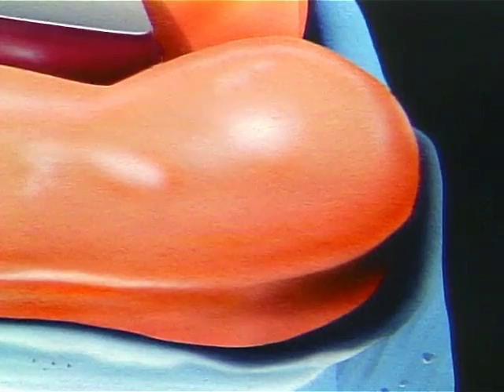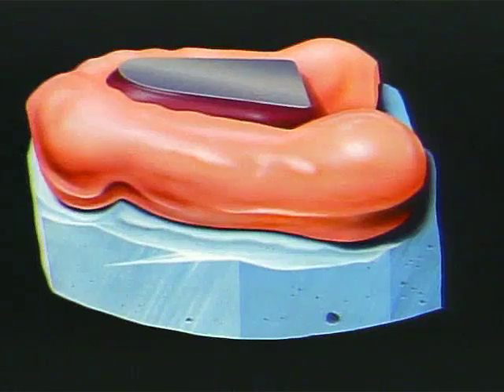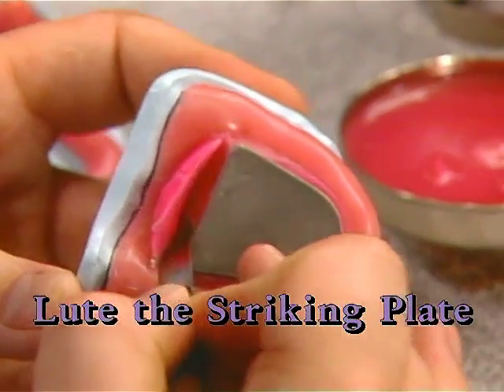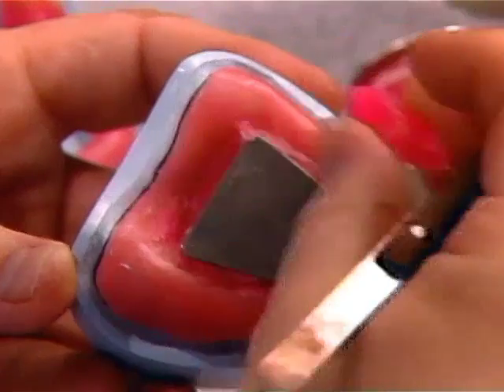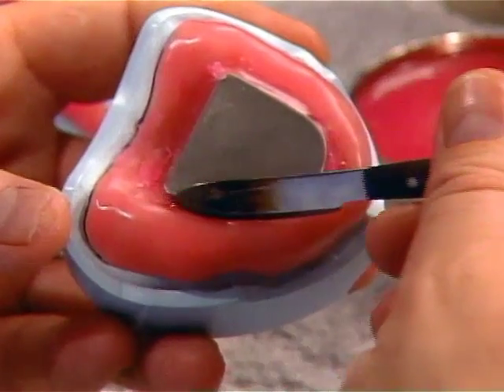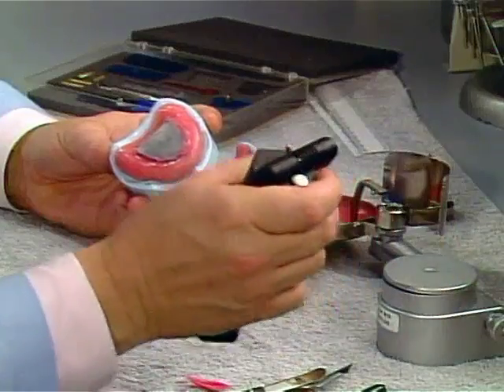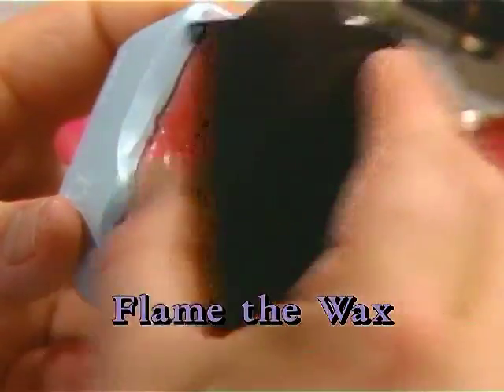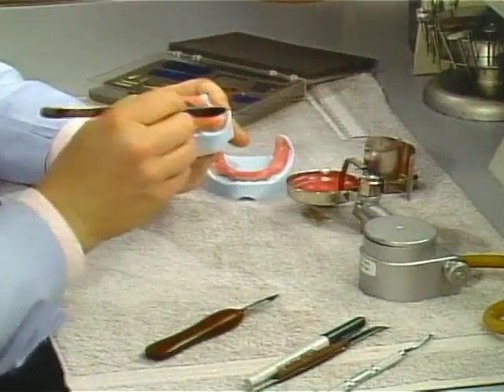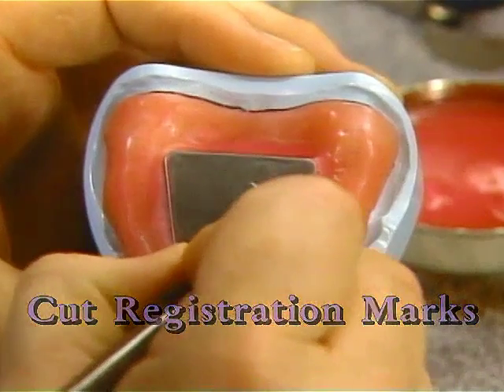Occasionally, bulbous tuberosities will force you to place the striking plate slightly forward in relationship to the base in order to maintain the upward slant at the back. Trim excess wax and lute the edge of the striking plate to the wax. Flame the wax lightly to produce a smooth surface. Cut V-shaped registration grooves in the wax on each side of the plate to create reference features in the plaster.